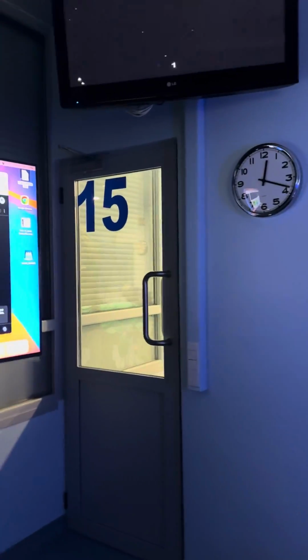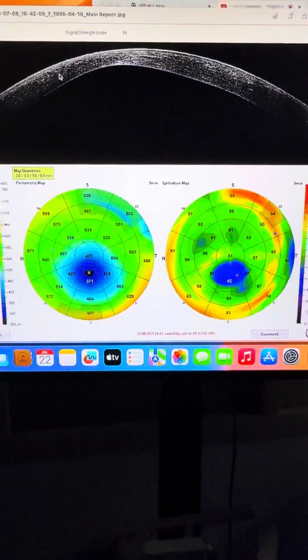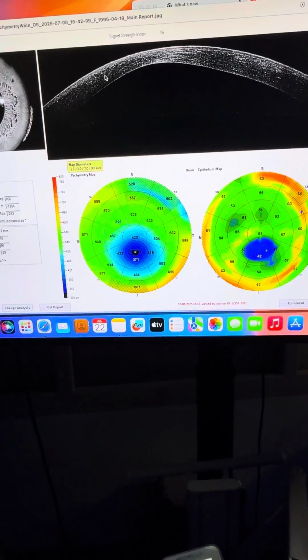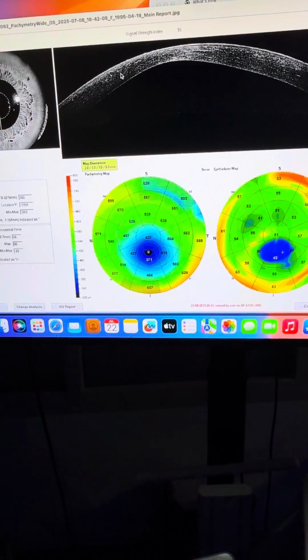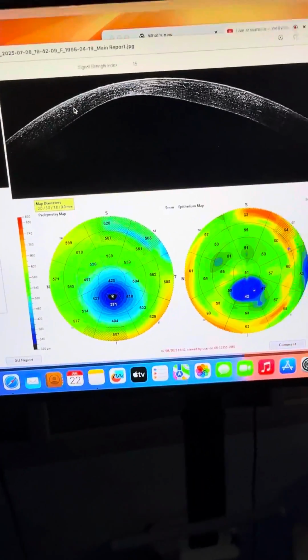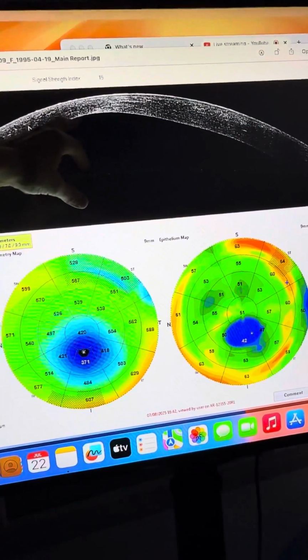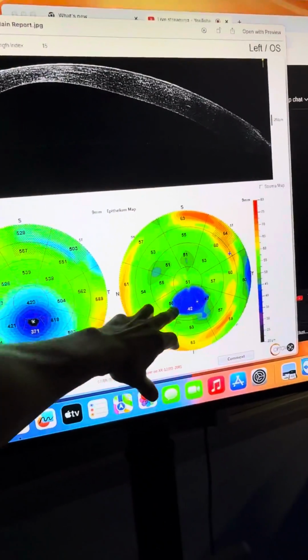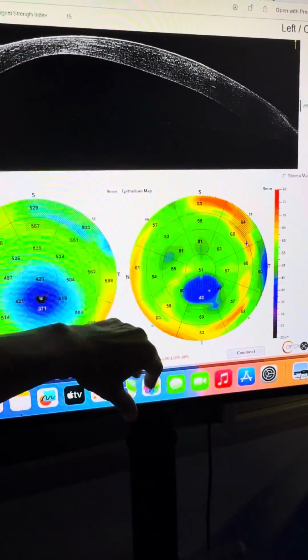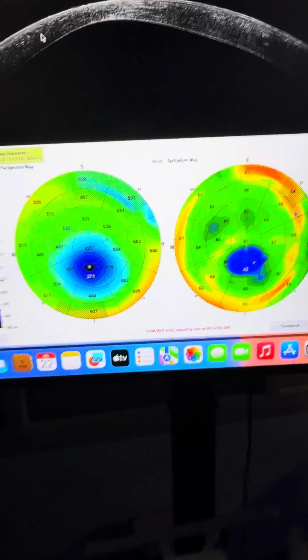We have here a young lady on whom we performed the Athens Protocol several years ago, in 2020, so it's been 5 years. She was stable for 3 years. Unfortunately, she did not cease the habits that created her keratoconus, which is obviously eye rubbing. We can tell that this is a treated eye because the cornea is more irregular on the back side than on the front side. But the epithelium here being blue tells us that she's an avid eye rubber. She sleeps face down and rubs her left eye a lot, and her keratoconus has worsened.